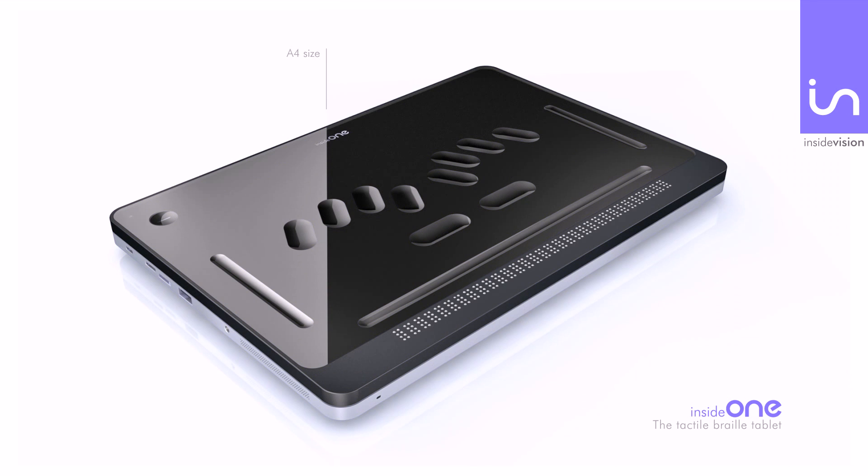An A4 size tablet. The tablet glass has been indented to create real keys of a braille keyboard, as well as functional areas around the screen. At the bottom of the screen you will find a 32-cell braille display integrated into the tablet.